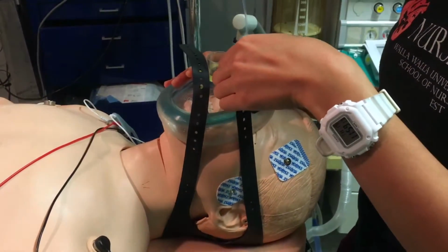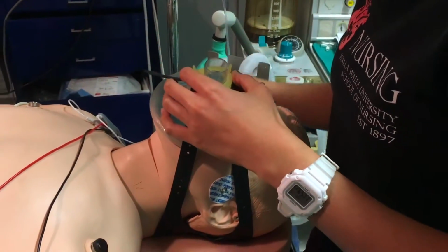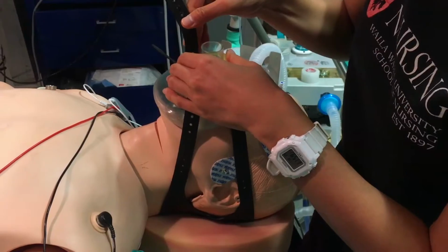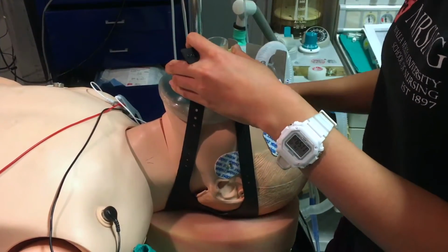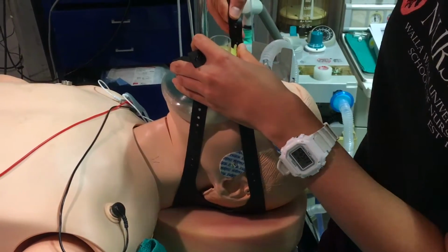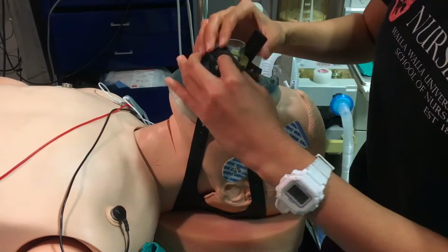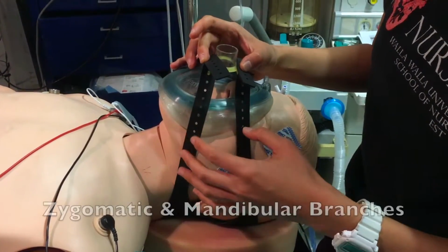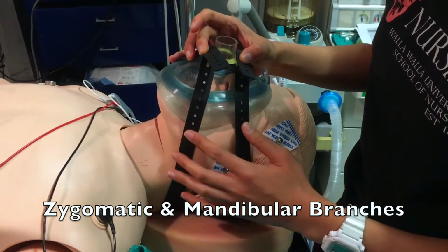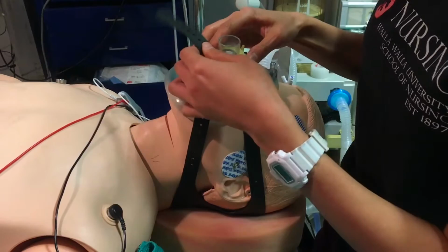It frees up your hand so that if you're the only one, basically you have no assistance in the OR, for example, this can secure the face mask while you get ready to get your airway equipment or get your drugs ready. The facial nerve branches that can be damaged with this are the zygomatic branch and the mandibular branch too. So you gotta watch out for that. Don't put it too hard against the patient.